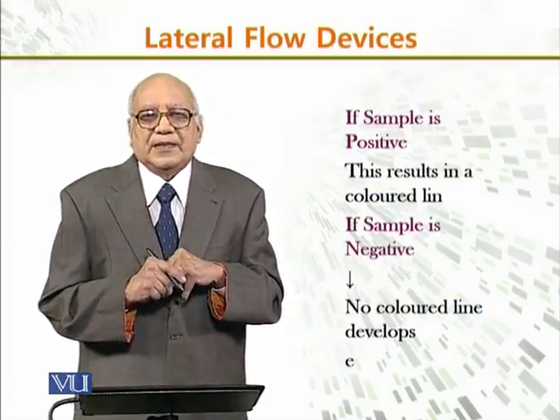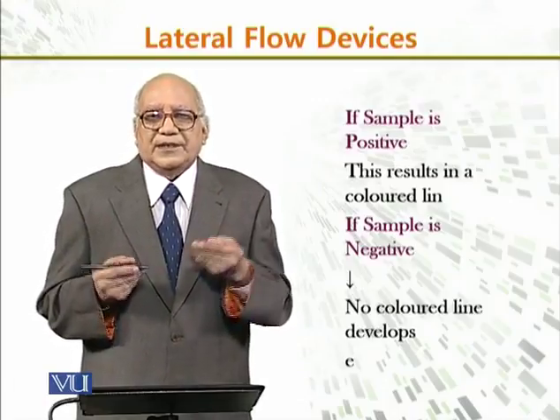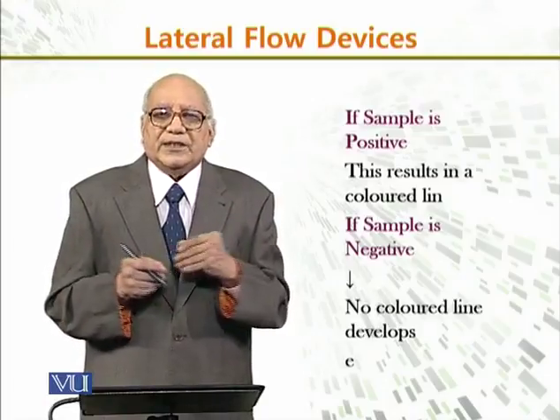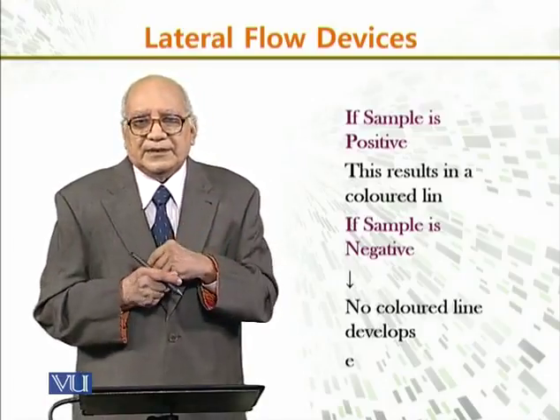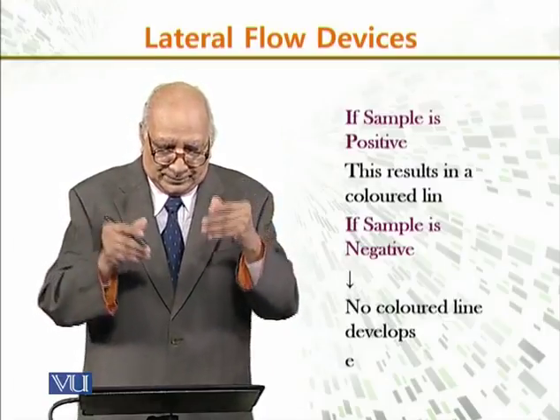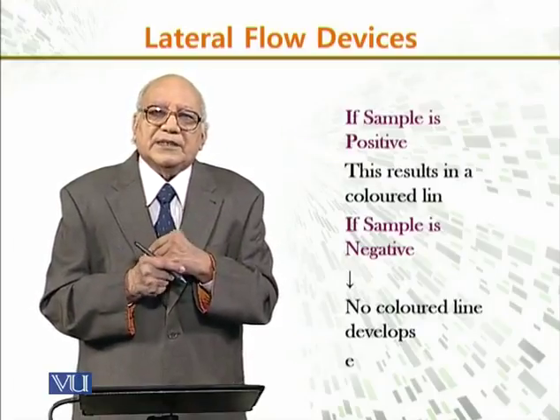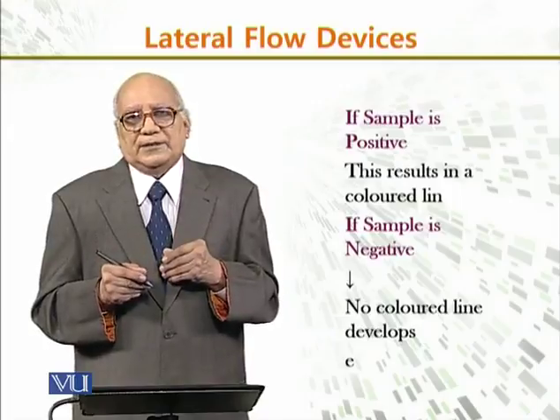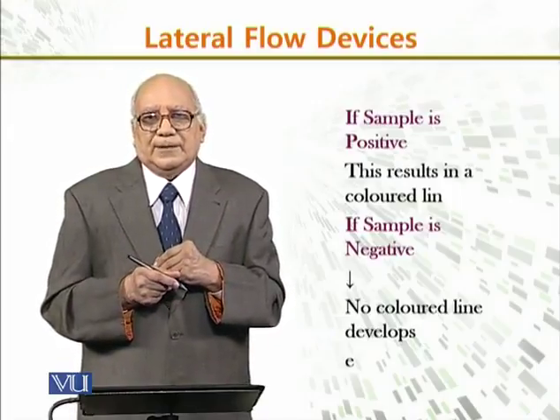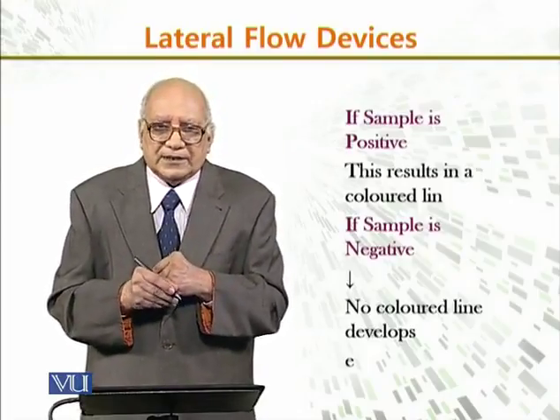If the sample is positive, this results in a colored line. If the sample is negative, no colored line develops. So the result is very straightforward, and it gives us a significant diagnostic indication.